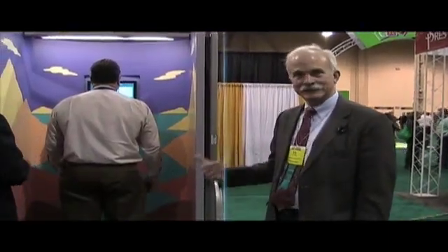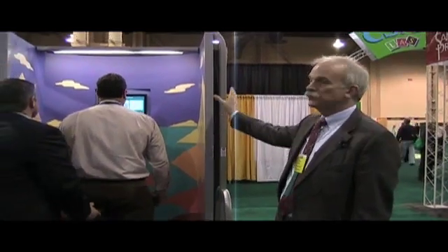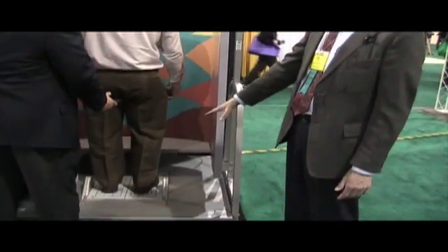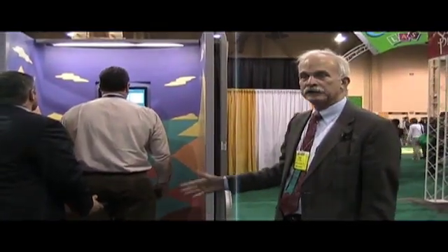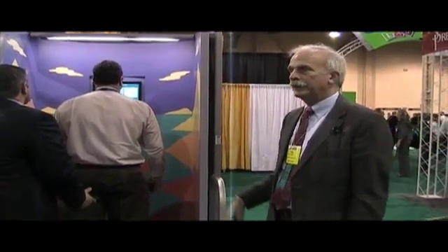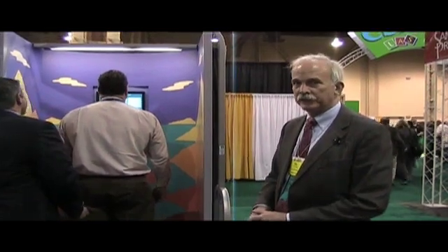This is condition six of the sensory organization test. It means that we're set up for sway-referenced visual surround as well as sway-referenced platform. What's happening is that if the patient sways, the environment he's in will react to that, making it very difficult for them to rely on surface information or visual information.